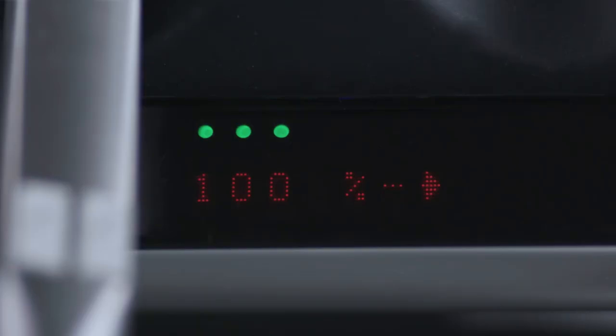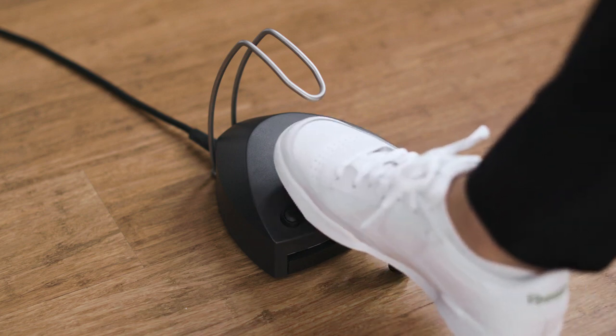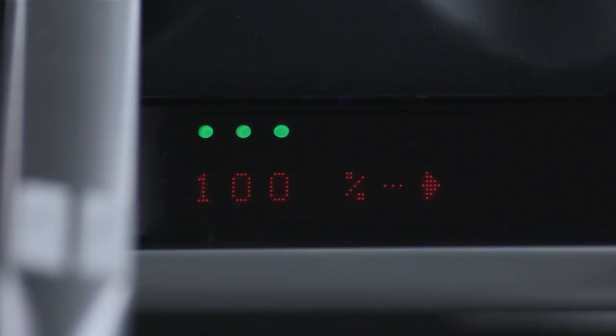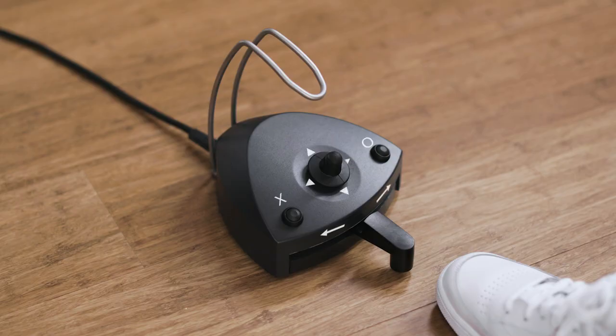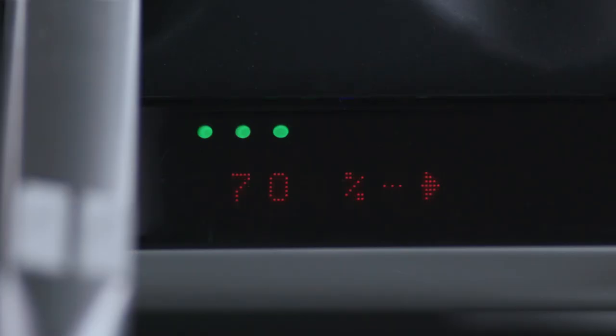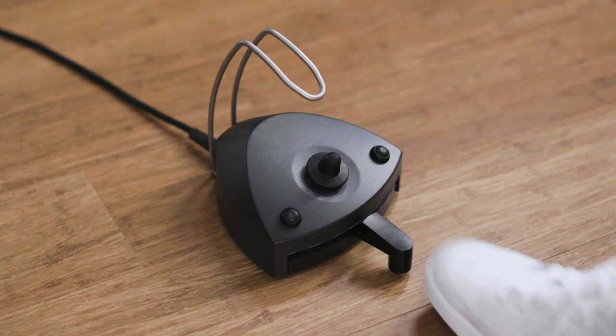Choose between three levels of irrigation. The amount of irrigation will increase when you move the joystick east, and will decrease when you move the joystick west. You can choose between three power levels. The maximum power will increase when you move the joystick north, and will decrease when you move the joystick south.